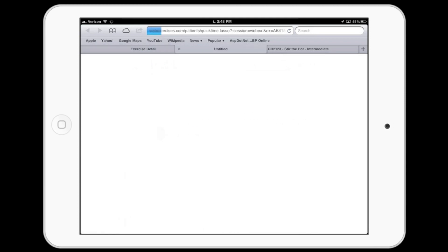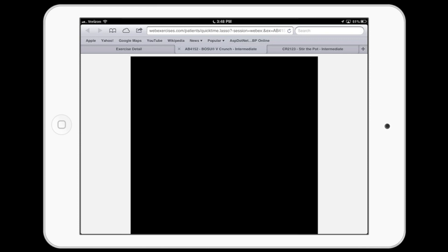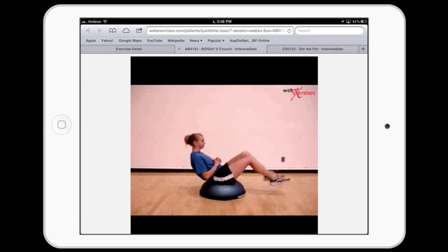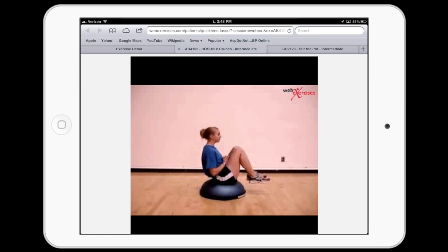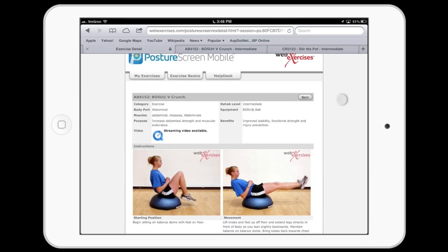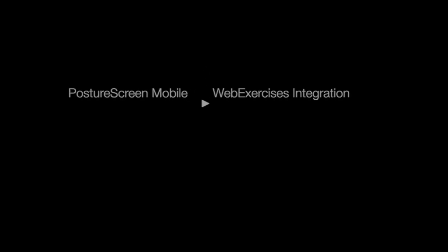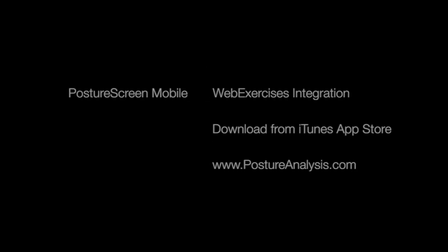If you have any more questions on how to utilize the WebExercise platform, feel free to reach out to us at info@postureco.com, and hopefully you enjoyed that brief tutorial on the WebExercise integration with PostureScreen Mobile. Thank you for taking a look.